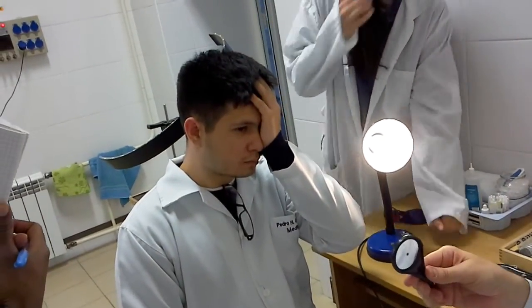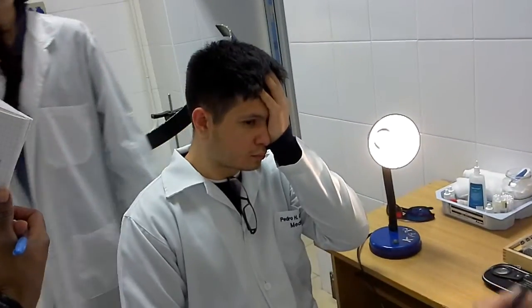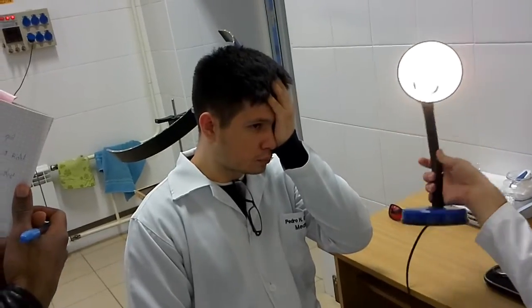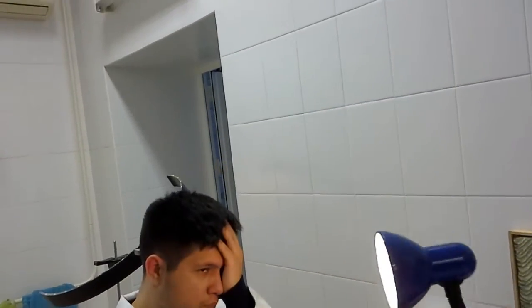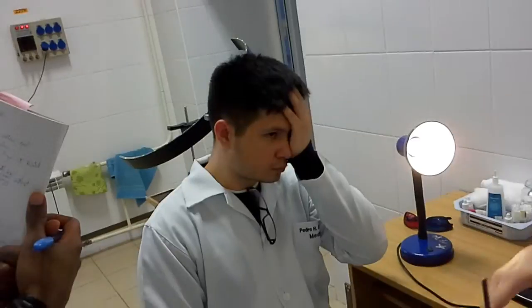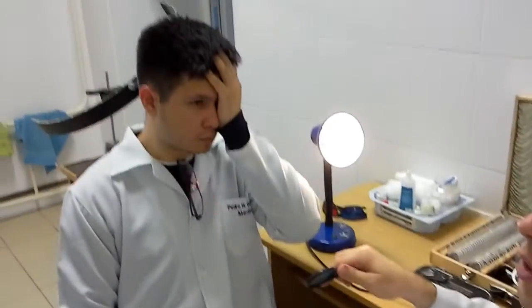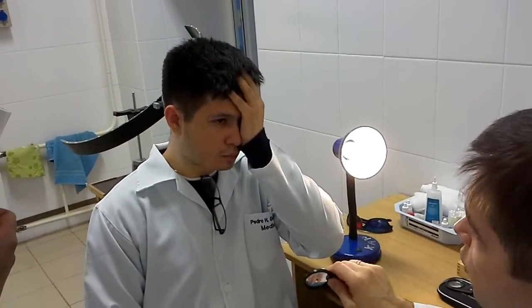And we use an ophthalmoscope. In your practical life, of course, you can use any source of light, maybe a pocket source of light, or even sometimes if you have no other equipment, take the lamp and ask the patient to say where the lamp is. Up, down, left, right. It's also possible. But during the credit, it must be comfortable, beautiful. So we ask the patient to recognize the position of the light, and we use, of course, a concave mirror, and we put the light from different directions.